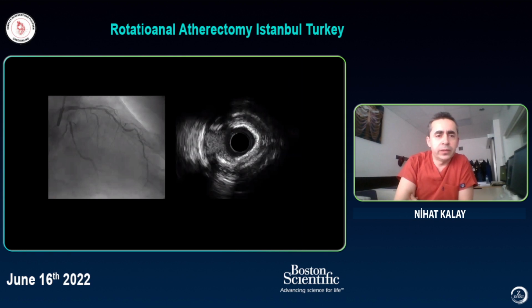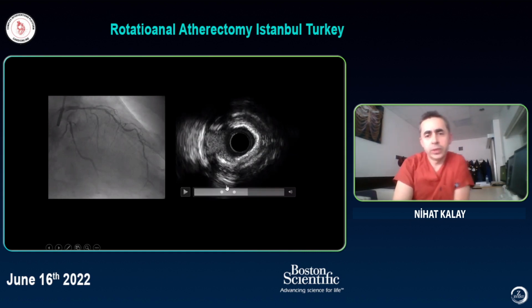I will show you one case example. Maybe there is an internet problem, actually the video format.